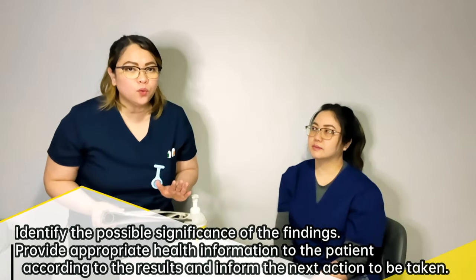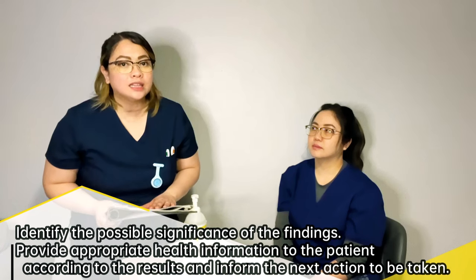You saw it on the screen. Make sure you complete the documentation, okay? You have to accurately document on the chart according to the strip, okay? According to our result, the patient's glucose is very high. That's the only reading that I'm concerned about at the moment.